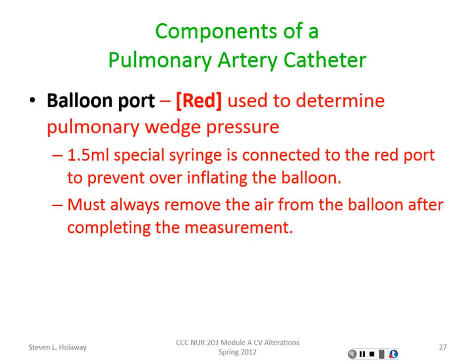All right. The red port basically is the balloon port. That balloon port is used for two things.